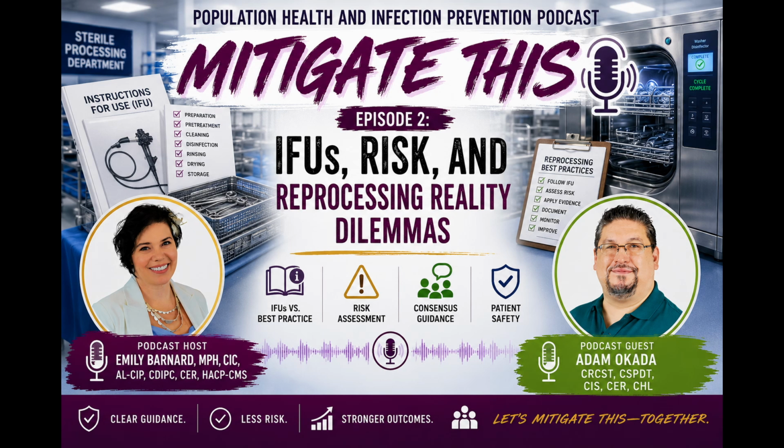So previously, the manufacturers were just creating solutions for surgeons or whatever it was, but now the government had oversight over the testing of the products. Are these things being tested before they're going to market? What does that testing look like? How do you prove that it's effective and it can be safe for patients?